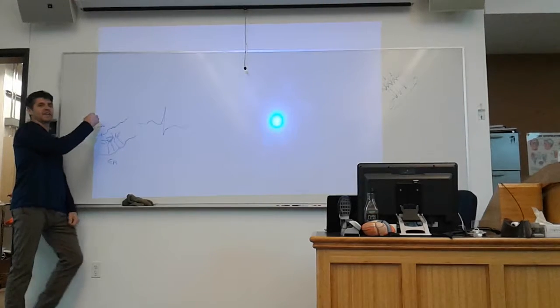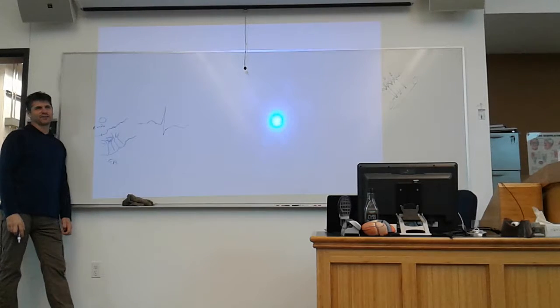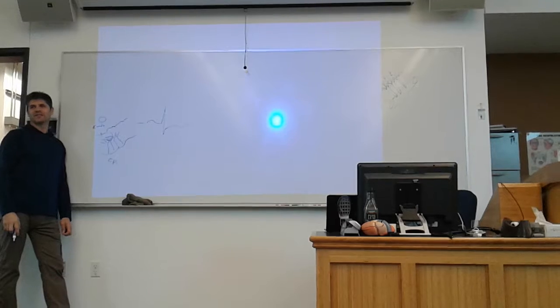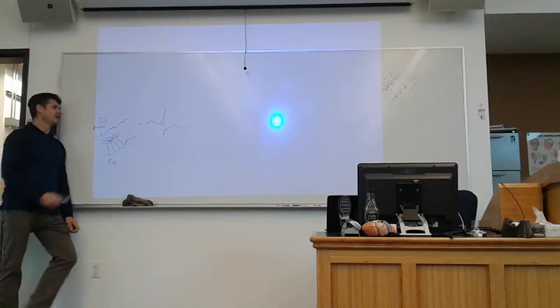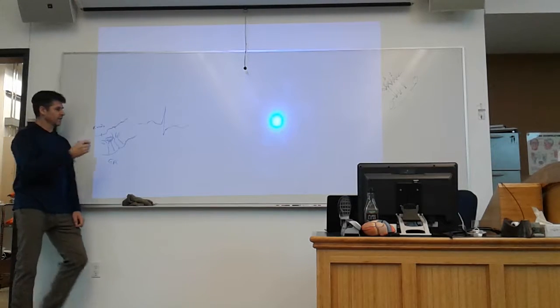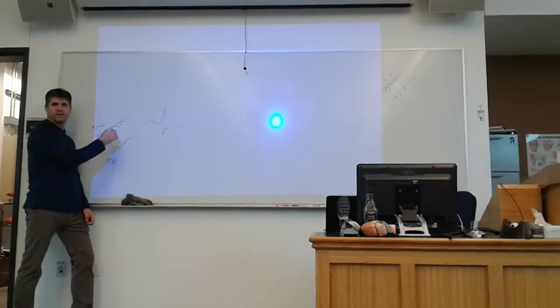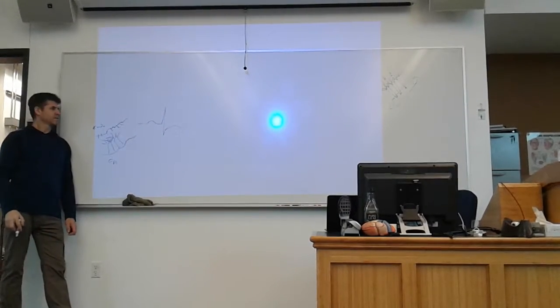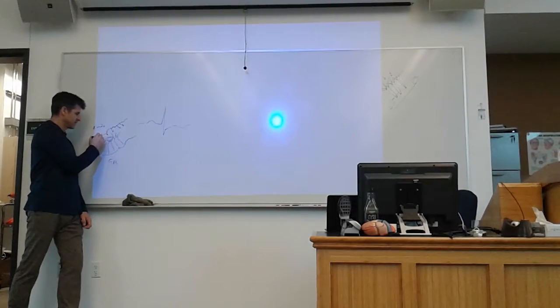So what is right here? What did I just circle? The ventricle or atrium, inside of the chamber. Be more specific. Yes, the whole thing is a ventricle. It's inside the chamber. So therefore, what would I have just circled? Blood. Okay. So there are some coronary vessels that come right out of the ventricle itself, right into the heart. That makes sense. Going into, but not very far. That's pretty cool.